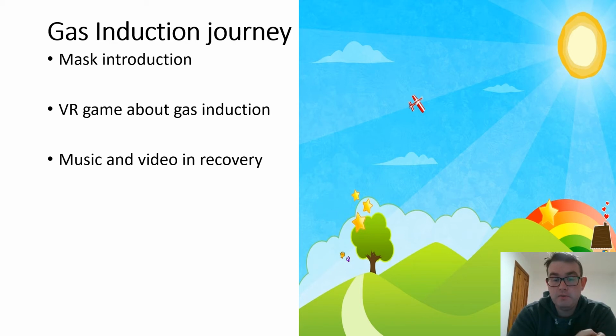So hopefully they'd be looking forward to receiving this game back again, and that would be reintroduced then at the time of gas induction, where they'd play a slightly different game of blowing up the balloon, or they could watch Pokemon or any other video that they wished to watch. After the procedure is complete, then the headset can be used in recovery to watch music or video there.